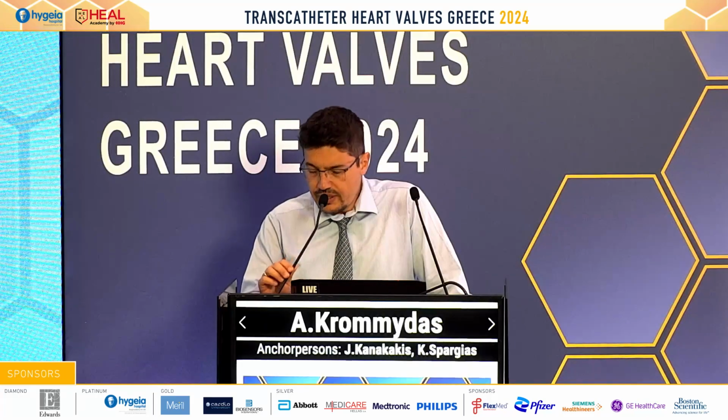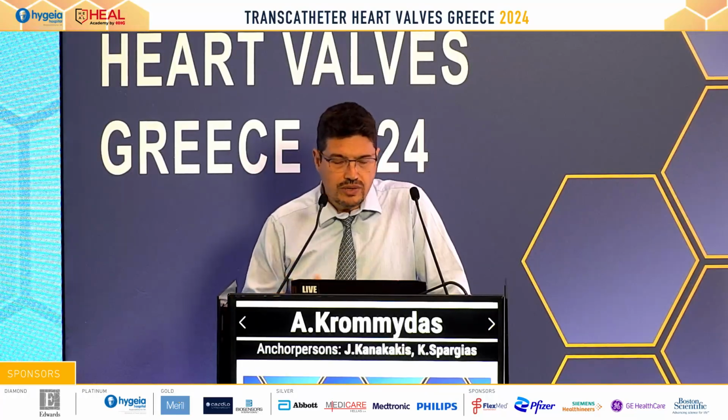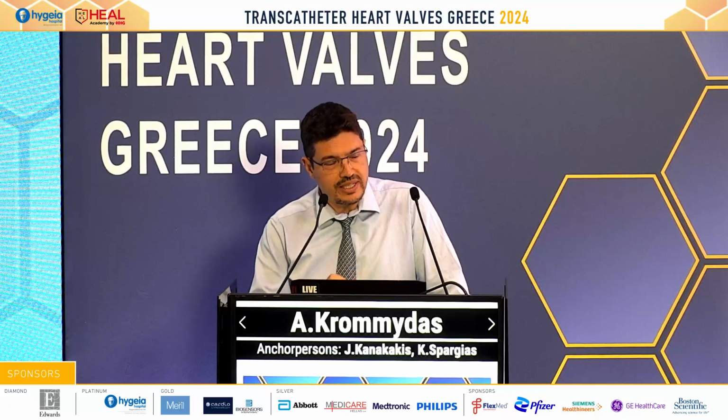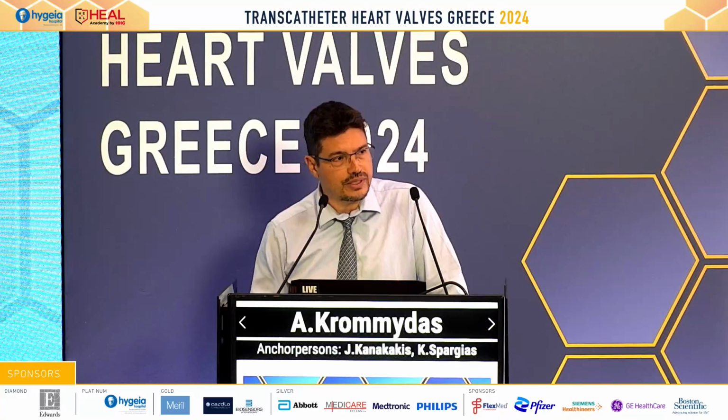Just one question, and then we can get other questions as well. As we're learning now, DVI, do you also measure it before the TAVI? I've heard that sometimes there are echocardiographers who tend to measure it. Yes, DVI I consider to be a very important measurement because it's independent of flow, so it reduces measurement errors, and also it's good to correlate it before the procedure and after the procedure and to see the change. It's a good relation to have in order to have proper assessment of the severity of the aortic stenosis. So I agree, yeah.